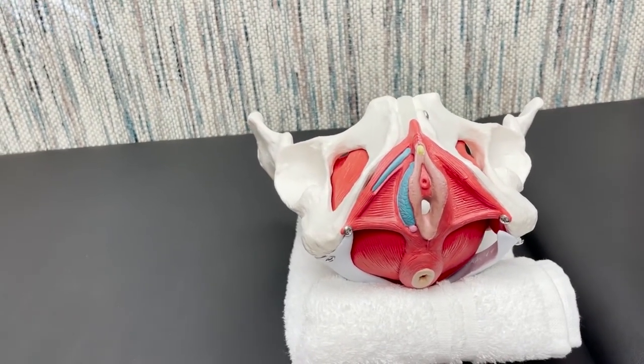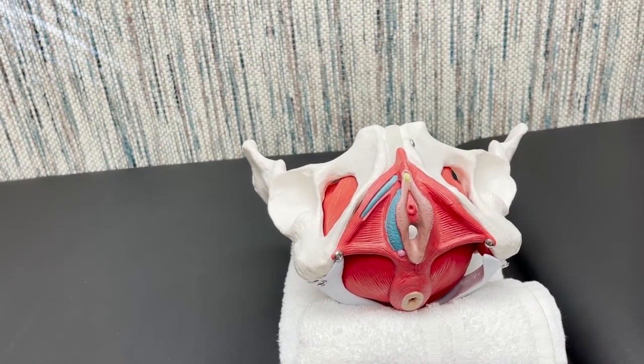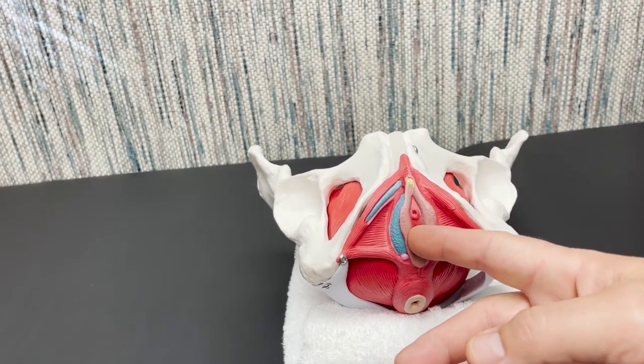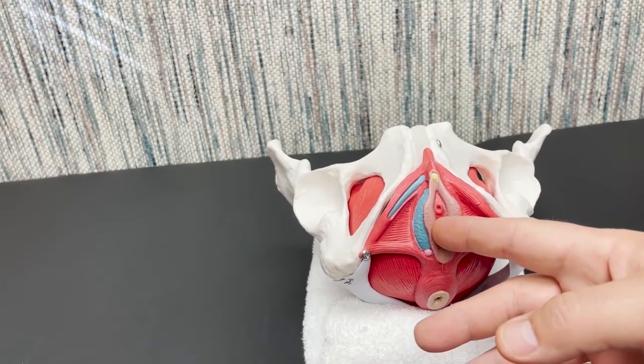We'll place an index finger into the vagina at the midpoint between the perineal body and the pubic symphysis. So we'd come in here. This is going to serve as a backdrop and allow for palpation of that muscle. We're going to avoid the labia and the clitoris.